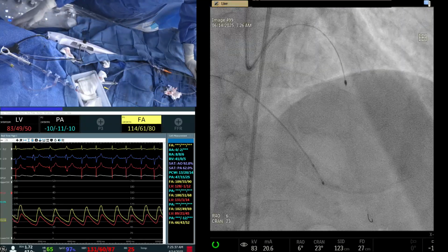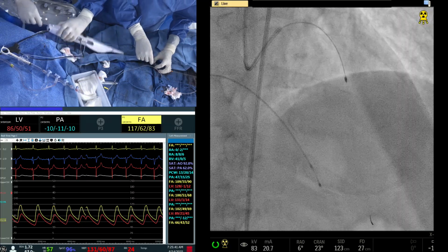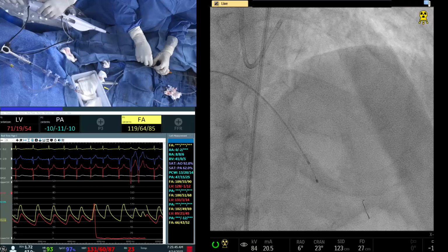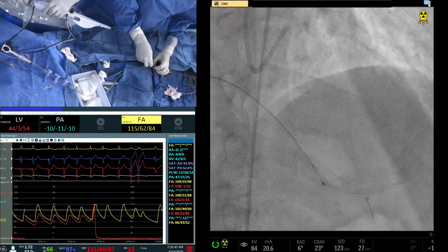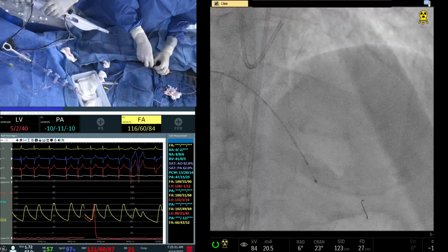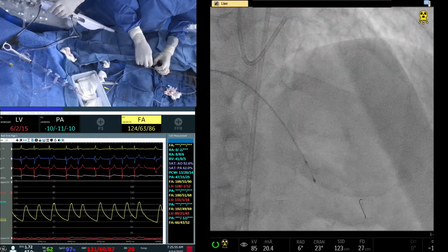Yeah, 20-second runs. Okay, start coming back. Run through wire, run through and Fielder both. Do you want to go back and upgrade it to 1.75 for the proximal alone, or do you want to go with a balloon? Yeah, very good point, actually.